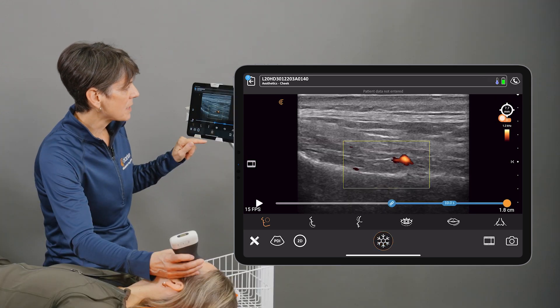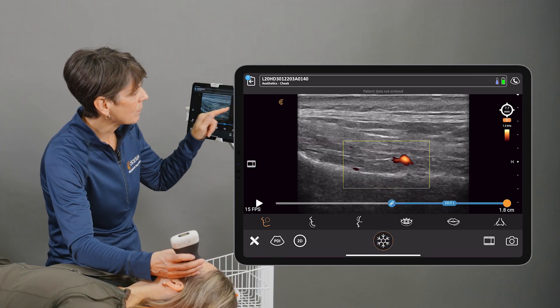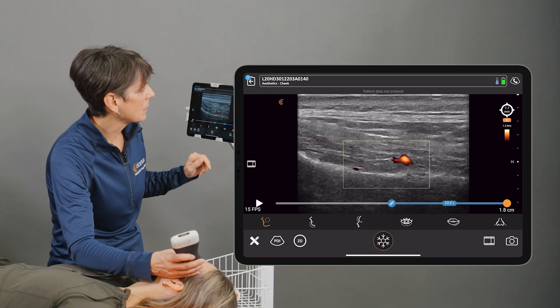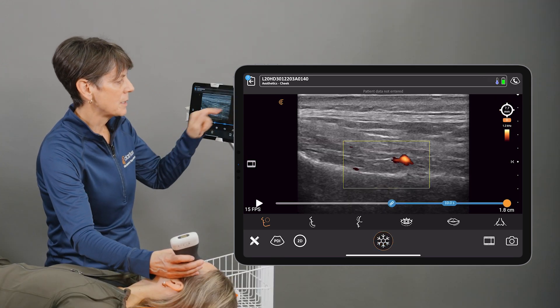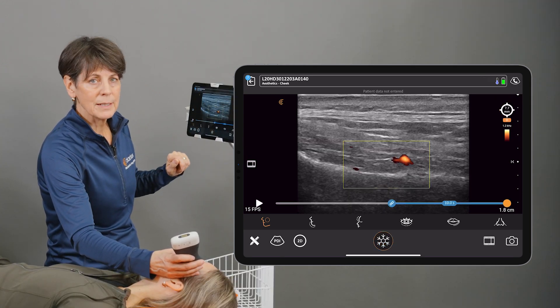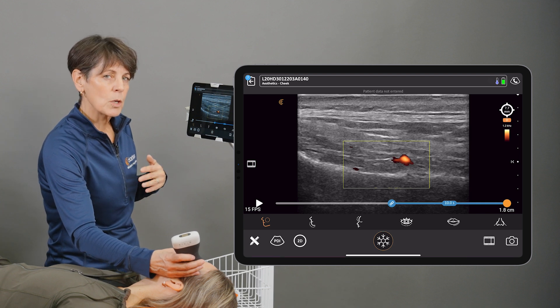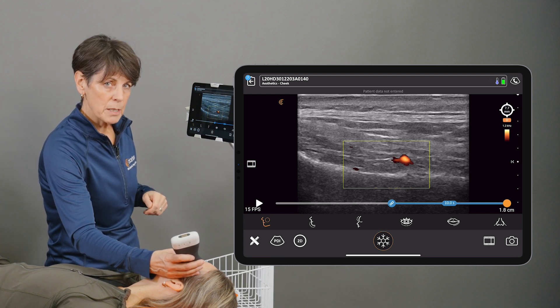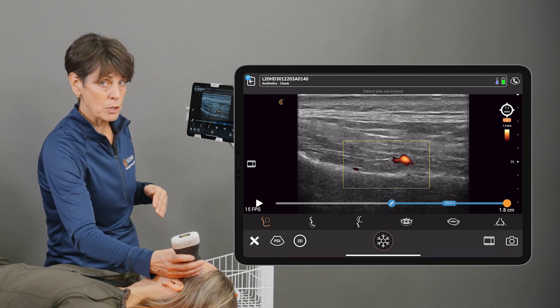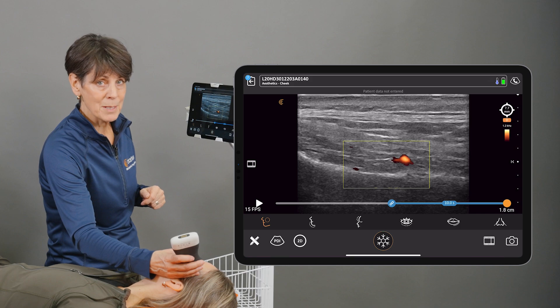And when I freeze the image, we're getting our depth displayed there. So that's a more hands-free approach so that you don't have to actually perform the measurement manually.